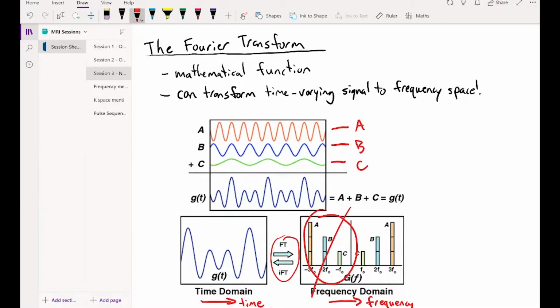We don't need to go into why, just because that gets into the actual math behind the Fourier transform. I did look it up and decided that it wasn't really worth mentioning. Essentially, the Fourier transform outputs are symmetrical, so we can just look at positive frequencies, and the negative frequencies are representing the exact same information.